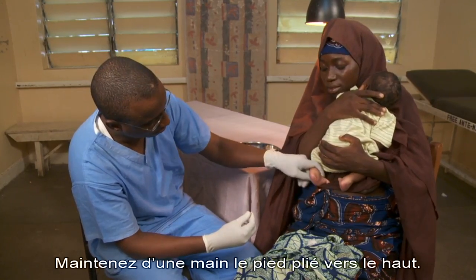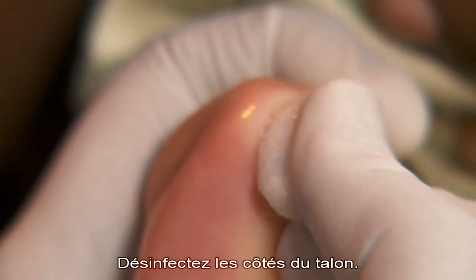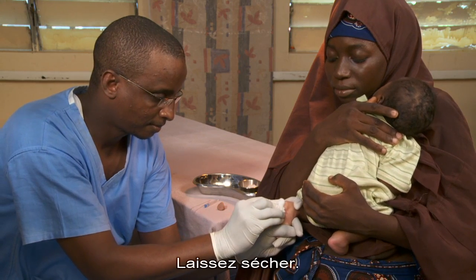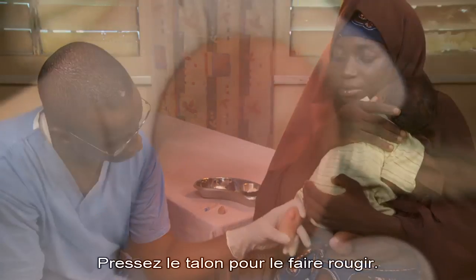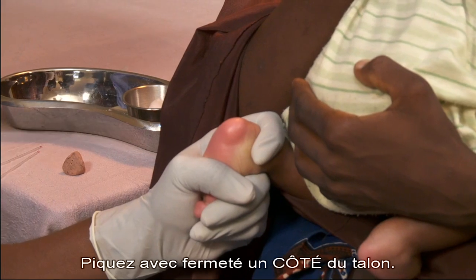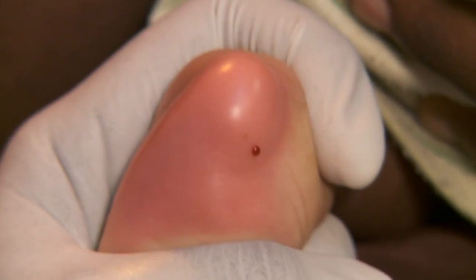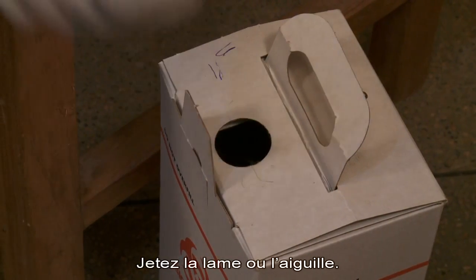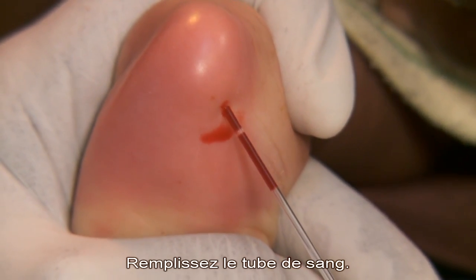Flex the foot upward and hold with one hand. Clean the skin on the sides of the heel. Allow it to dry. Squeeze the heel to make it flush red. Then, puncture the side of the heel firmly. Safely dispose of the sharp.